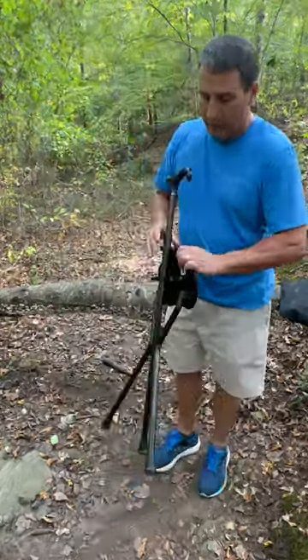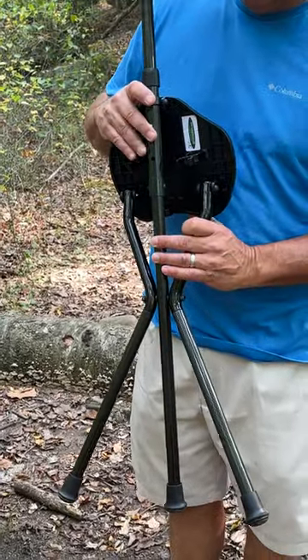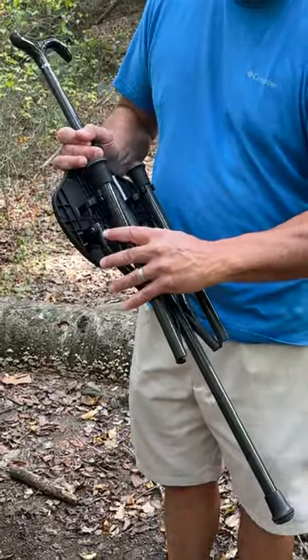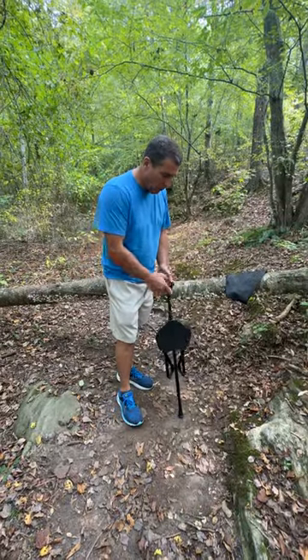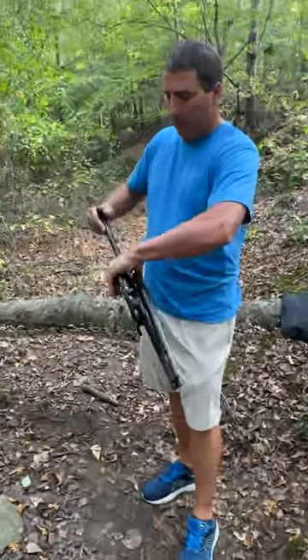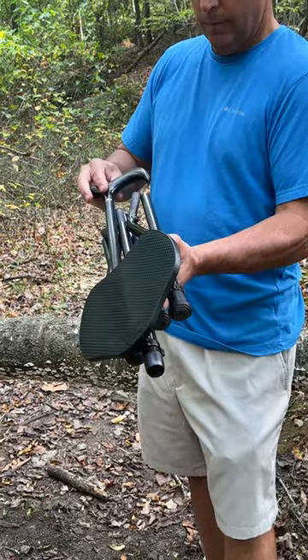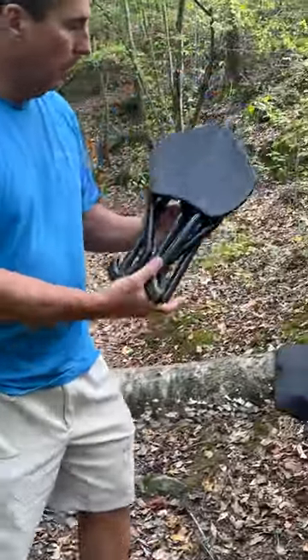Very convenient. We're going to snap it back into place to make it back into a cane. You've got one leg in place, the other second leg in place — now you're back to a cane in one, two seconds. So to fold it back up and put it in the case, simply do that. Pull up the cane, this pops into place, and you put it in the case.